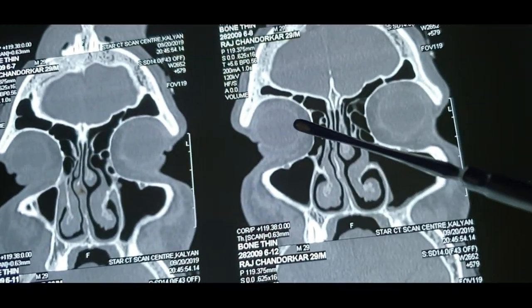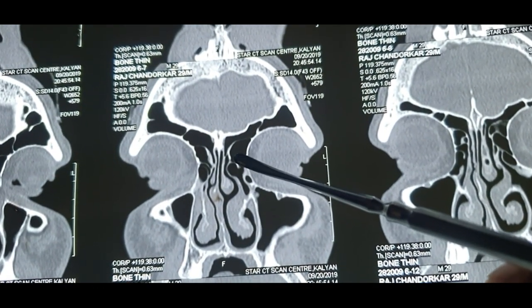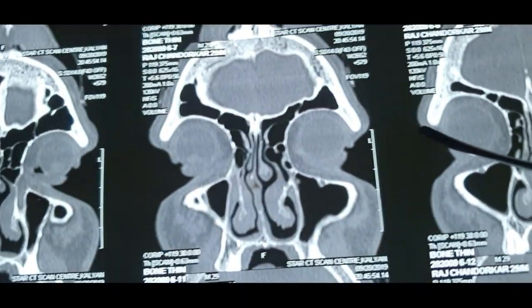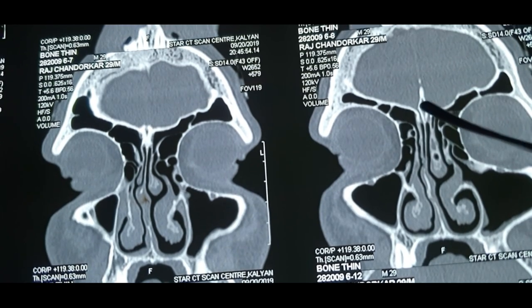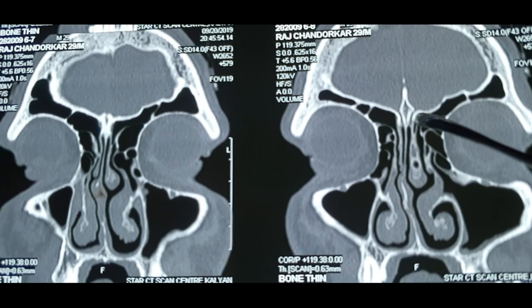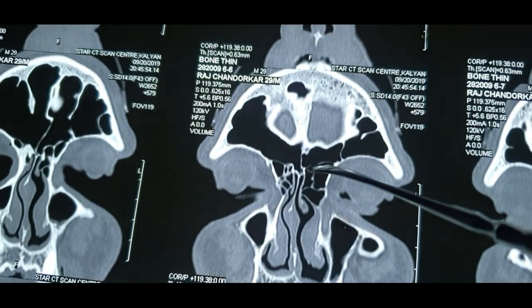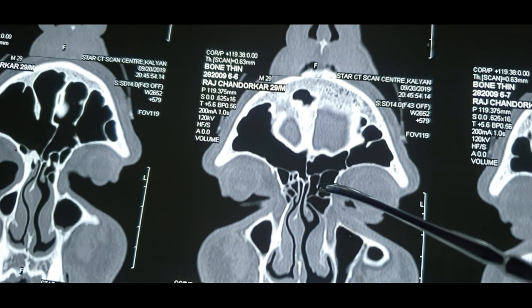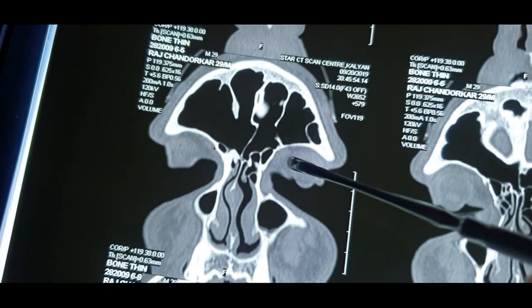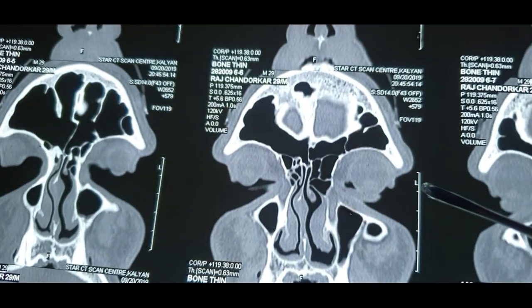This is the frontal recess area. This is the most posterior aspect of the frontal recess. Beyond this, you cannot see the frontal recess. This is the anterior ethmoids. This is the crista galli, which is big and marks the beginning of the anterior cribriform. This area in the frontal recess is showing a few cells. Now I'll clear up what cells they are. We all know the basics: anteriorly the agger nasi, posteriorly the bulla ethmoidalis.